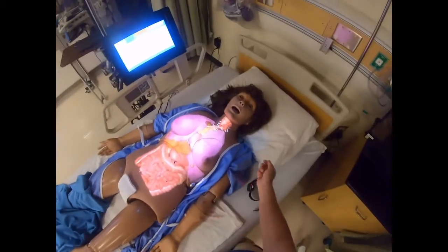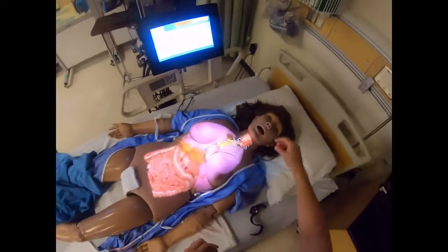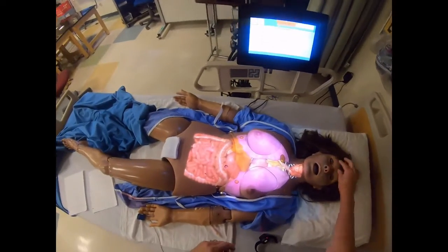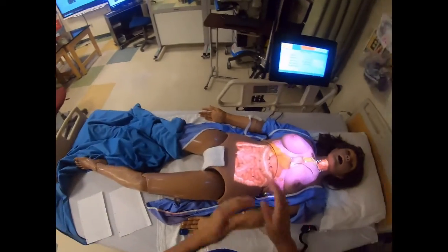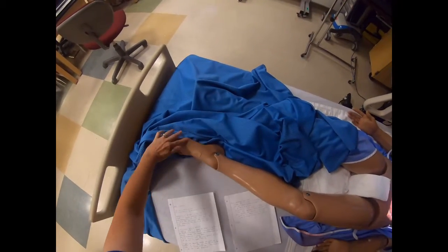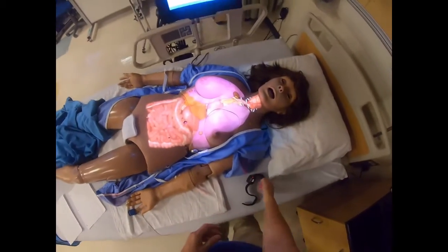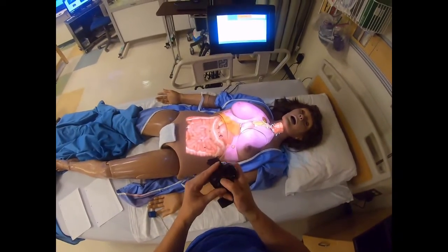Other places we can go ahead and put a pulse ox probe, and these would be disposable probes because they are more flexible, would be your patient's earlobe. We can also do across the bridge of the nose sometimes. For children, we can use the ball of the foot. And what we would do is wrap it around the ball of the foot, and we would be able to obtain a pulse oximetry that way.